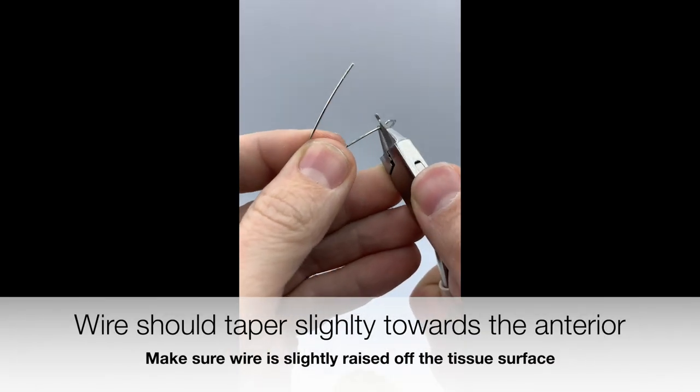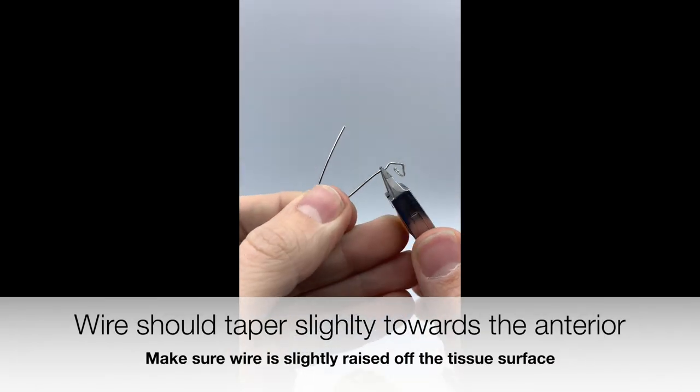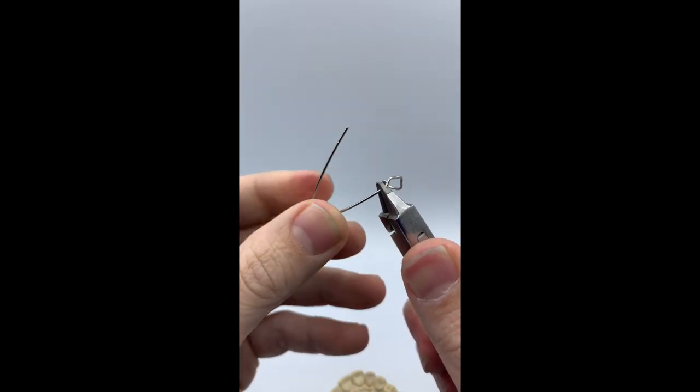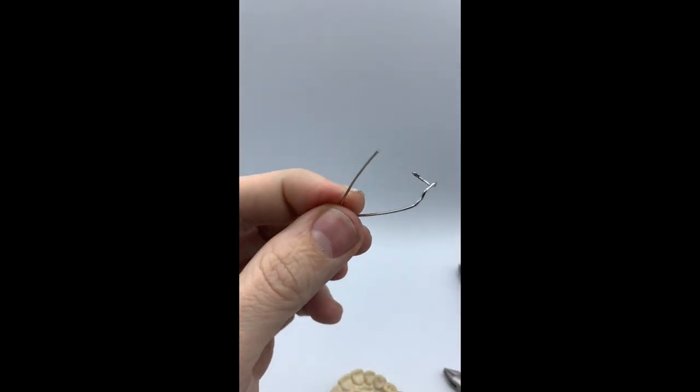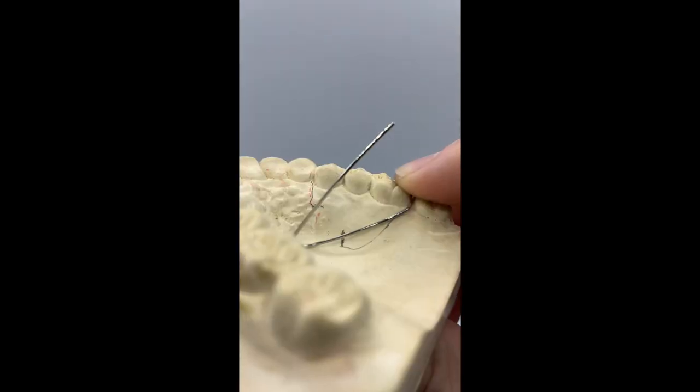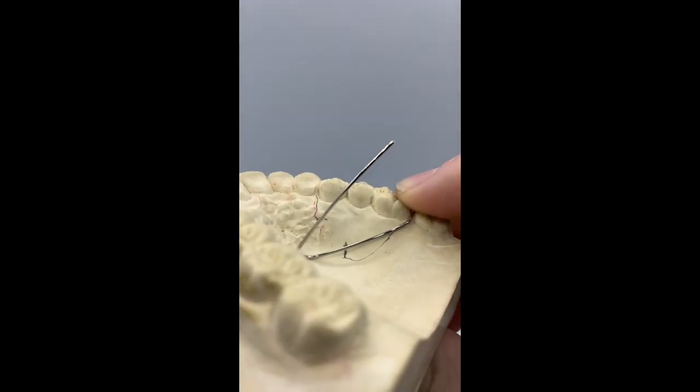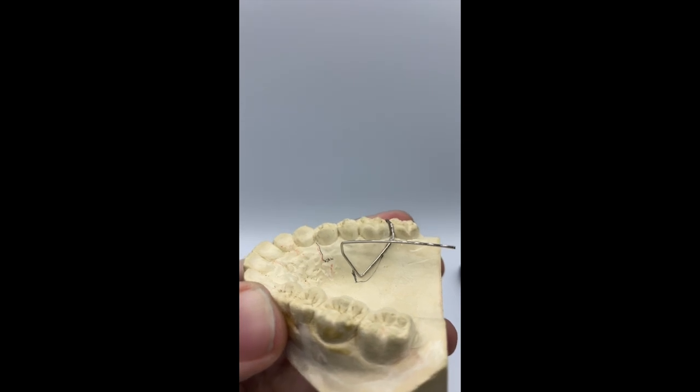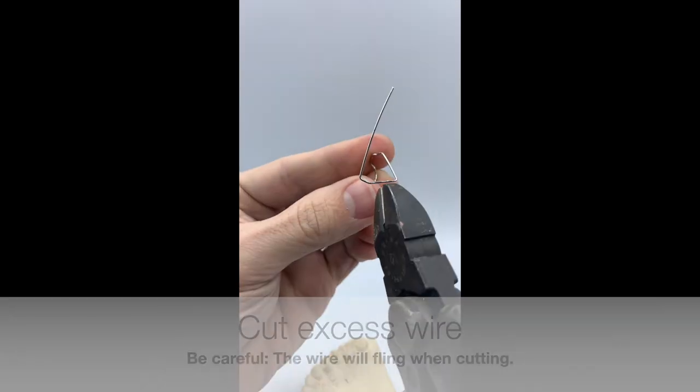We are now going to bend our wire towards the mesial to finish our tail. Remember, the wire should not contact the tissue surface. It should be slightly above it so that acrylic can flow underneath it.